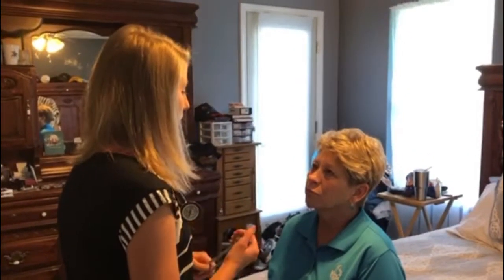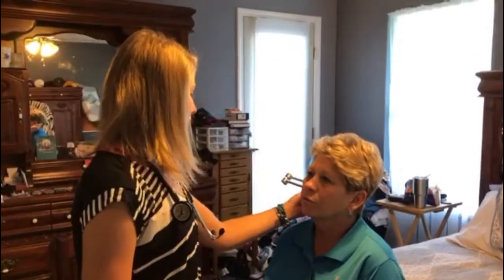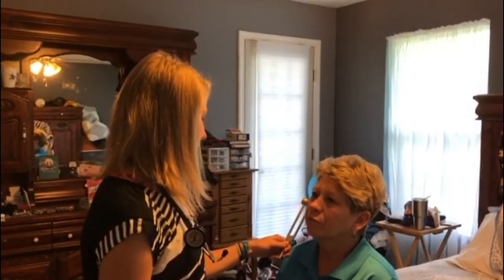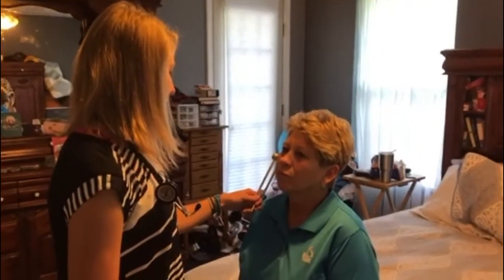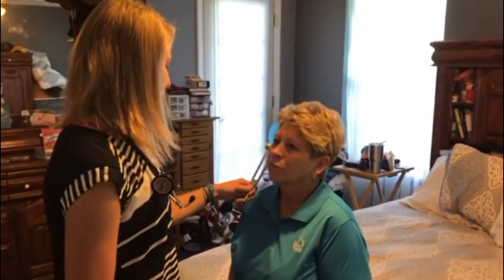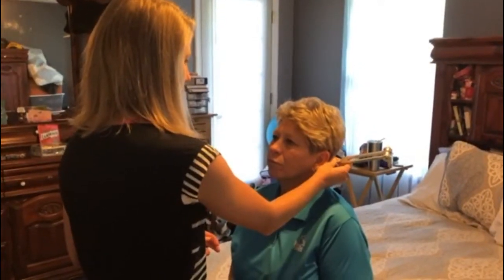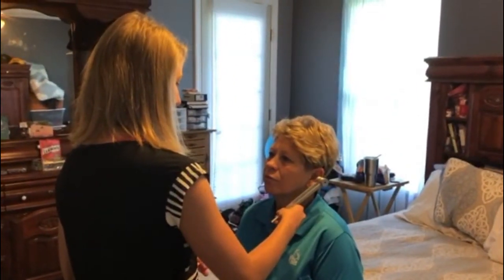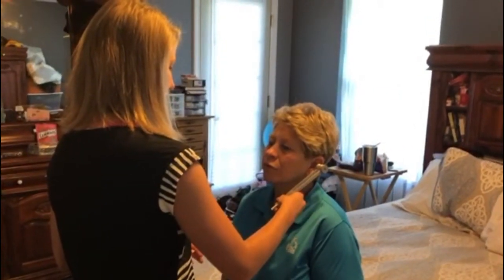Okay, and now we are going to complete the Rinne test. Just let me know when you stop hearing it, and then we'll move it, and then let me know again when you stop hearing it again, okay? Okay. Stop. Stop. Okay, very good. Now we'll do this here. Stop. Stop. Okay, very good. She had normal findings. Her air conduction was 2 times longer than her bone conduction, which are both normal findings.